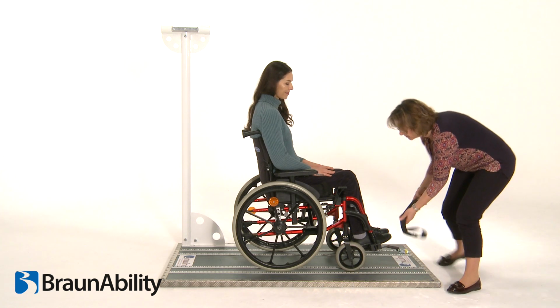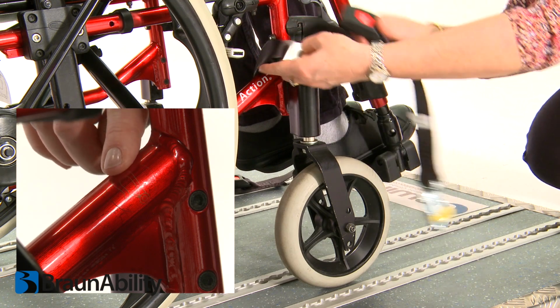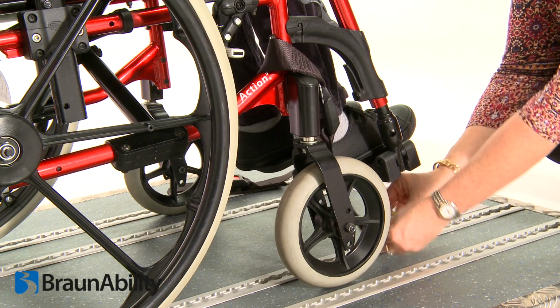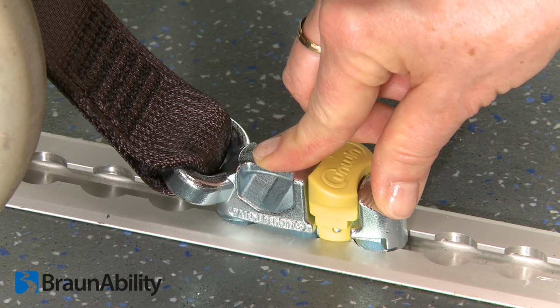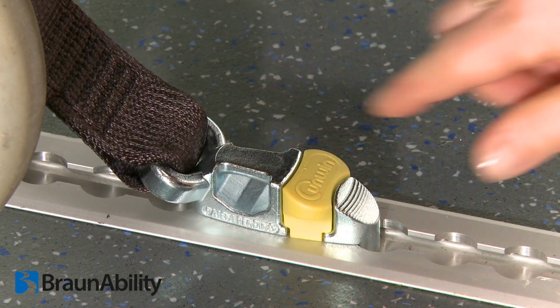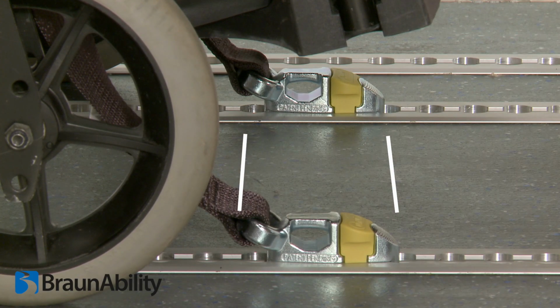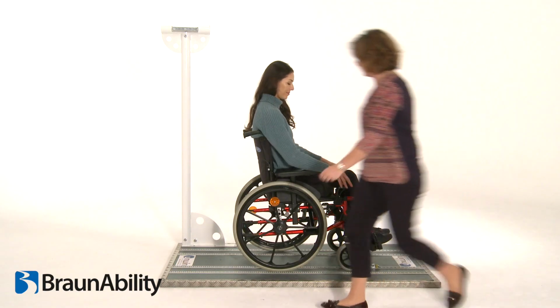With the buckle facing outwards, fasten the front straps to the front wheelchair frame on the designated front tie-down attachment point. Press down on the ribbed part of the aluminium track fitting, or ATF, and push firmly towards the wheelchair until the yellow clip drops and locks into place. Install the second tie-down, ensuring that the position of this is parallel with the first, and repeat the procedure.